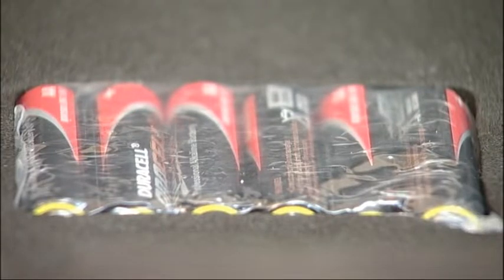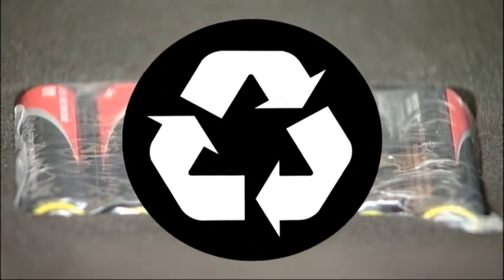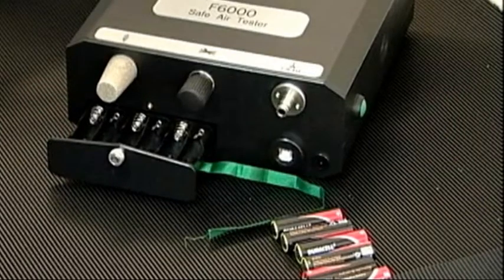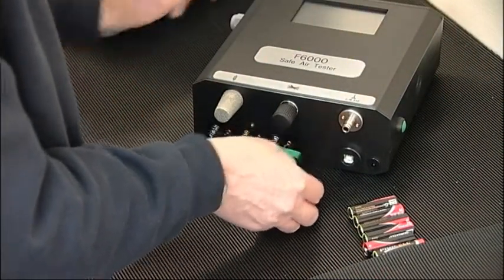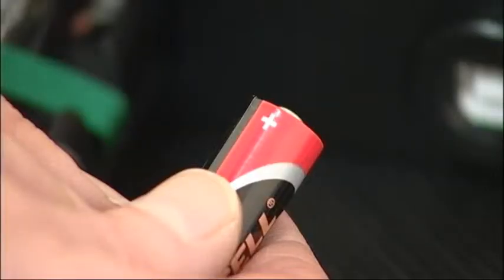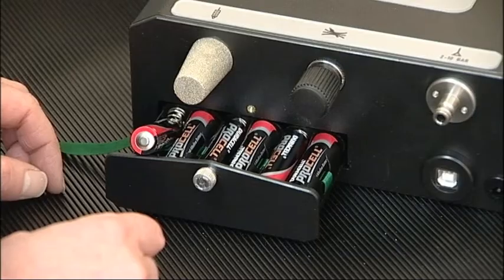Testers are supplied with batteries packed separately. Please note, rechargeable batteries are not suitable for use with this instrument. These must be installed prior to use, unless it's the intention to power the units solely from the mains. The ribbon should be laid underneath the batteries to allow them to be easily removed at a later date. When fitting the batteries, it's important to observe the polarity and ensure they are correctly located.